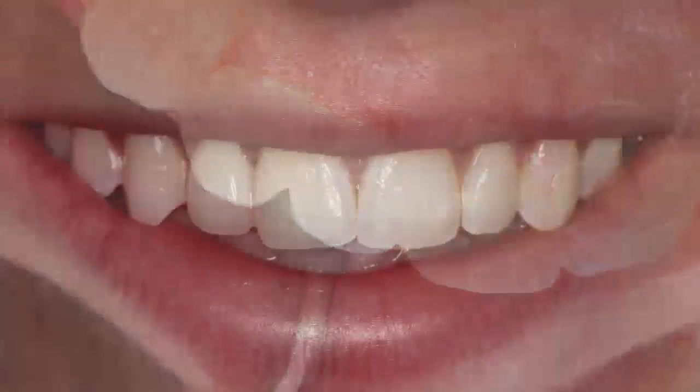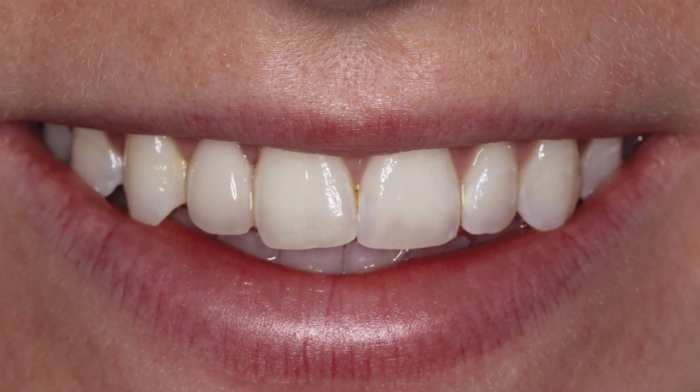The acid-etched bridge was indeed nice and aesthetic. However, the patient was mainly concerned about long-term function. There was no indication to prepare the adjacent teeth for a conventional 3-unit bridge. Although there were no medical contraindications to implant therapy, the amount of space between the adjacent natural teeth was minimal.